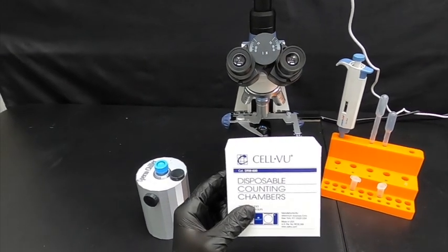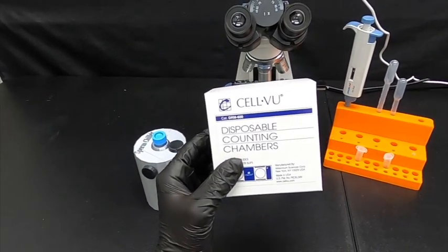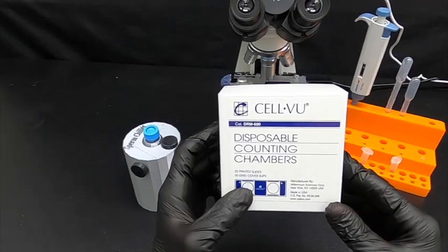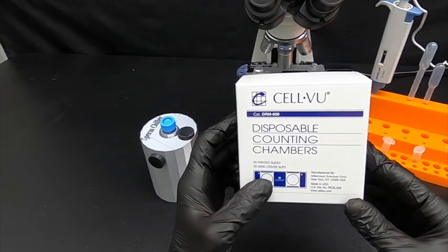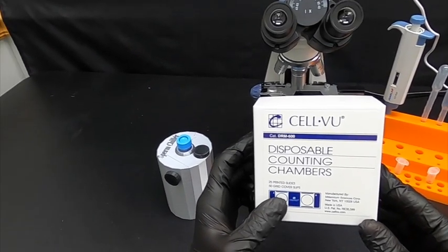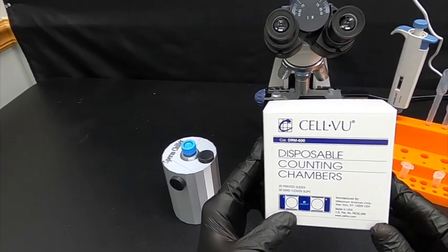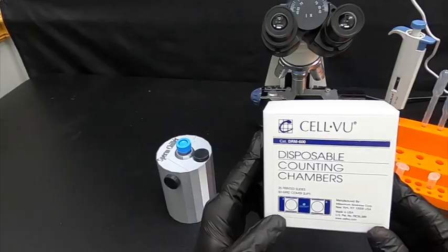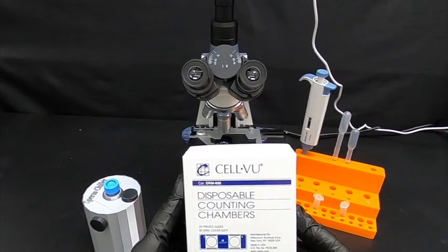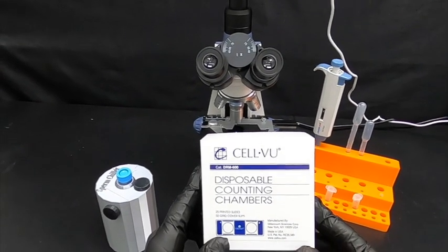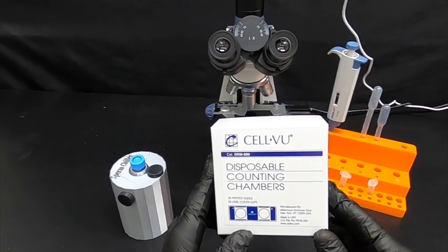Today we're going to demonstrate the use of CellView disposable semen counting chambers. These are used to get an estimation of concentration in millions per milliliter. This will not give you percentages on motility or progressive motility, but it will give you a fairly accurate count of your concentration, either via raw or extended samples.